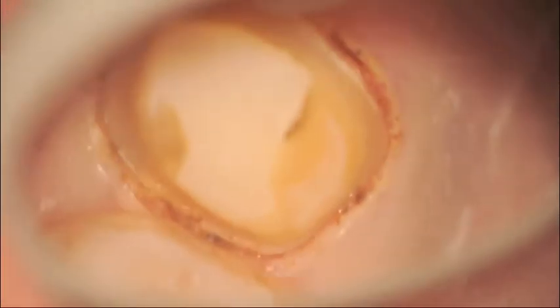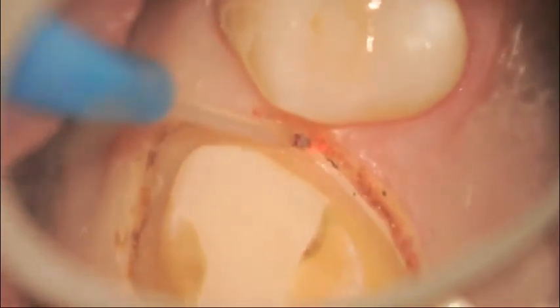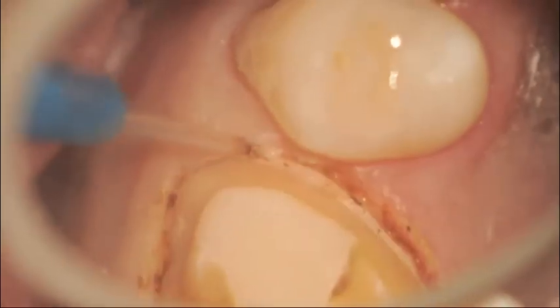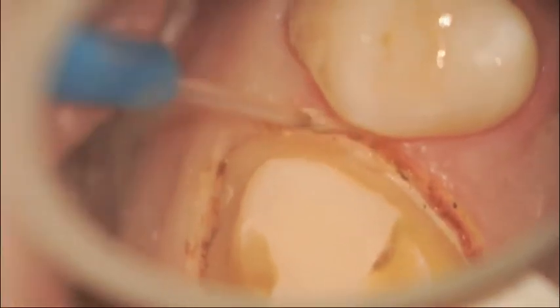What I'm looking for are small areas where perhaps the tissue is still in the margin, like on the distal, where I just want to remove that tissue so that the impression is picked up clearly by the polyvinyl siloxane impression material. Moving now to the mesial, I'm doing short brush strokes to create a separation of the tissue from the margin so the lab can clearly discern where the margin ends and where the tissue begins.